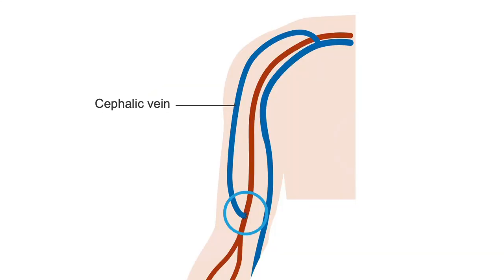This image of a brachiocephalic fistula shows the four locations you should take measurements of the cephalic outflow vein. These are at the anastomosis, at the proximal point which is in the distal upper arm, the midpoint, and then the distal point which is in the proximal upper arm.